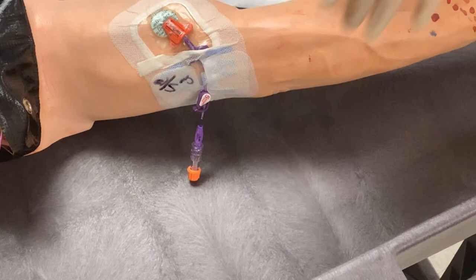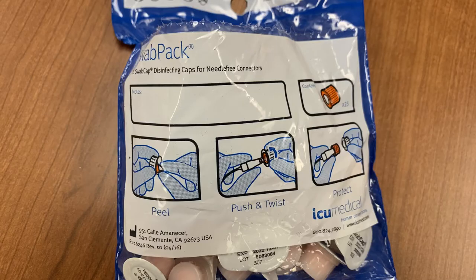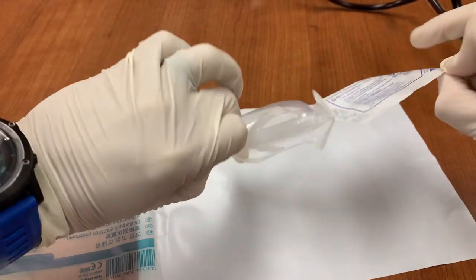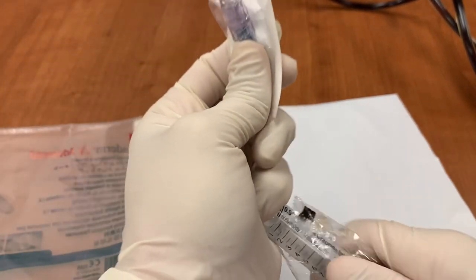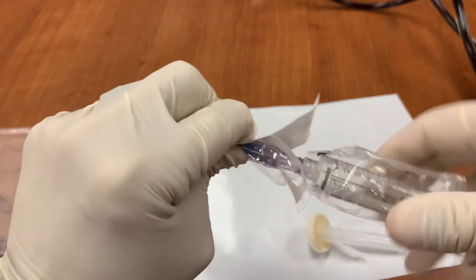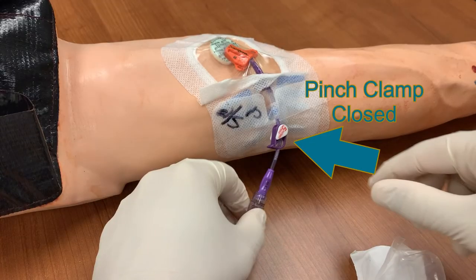With the dressing in place, it is time to replace the microclave end cap. You will need a new end cap, a flush, a small chlorhexidine swab, and swab caps. Begin by dropping the chlorhexidine swab on your sterile field. Next, open the end cap to reveal the needleless port. Attach the saline and prime the cap by flushing it with saline. Before you begin, make sure the pinch clamp on the catheter is closed.